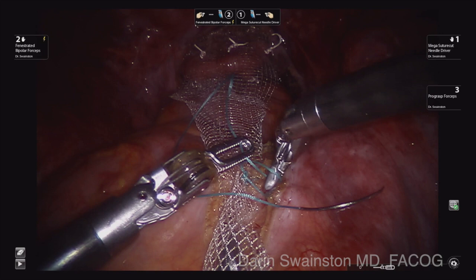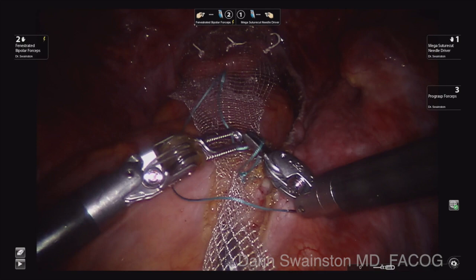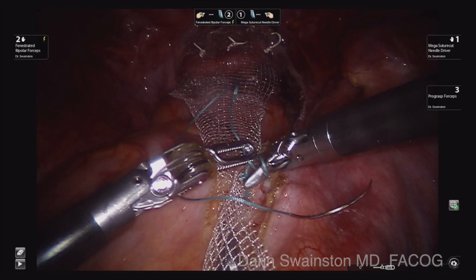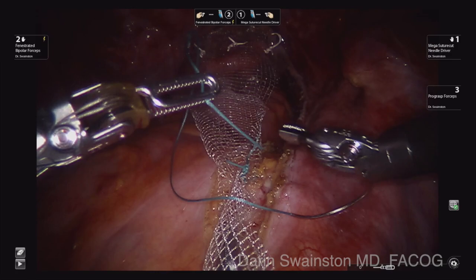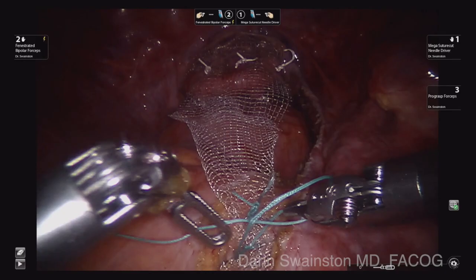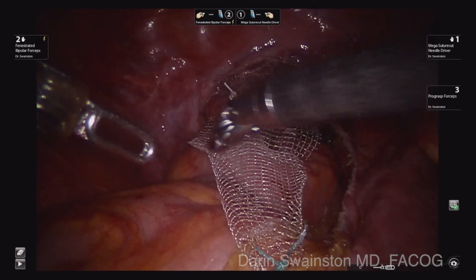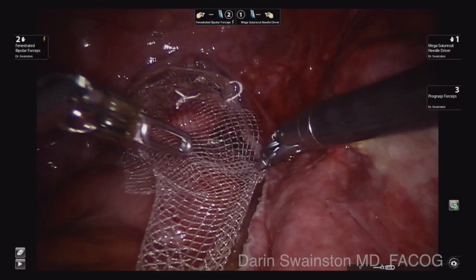I put two sutures here. Some people say you can do it with one, but if one fails you have the second one as support. This is a difficult surgery — you do not ever want to come back and redo it, so you want to do it right the first time. I do the same thing: square knot to slip knot. And now I am done. We can trim that mesh — give yourself a little tag there, do not want it too close to where you attached it. Now we can look at our work, re-examine, and start re-peritonealization of this whole area.